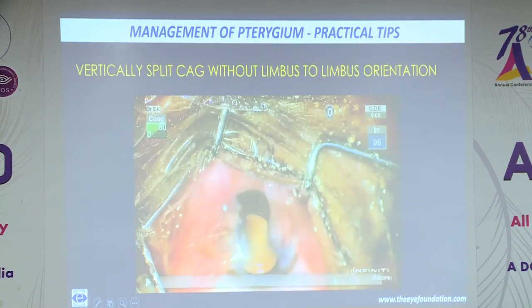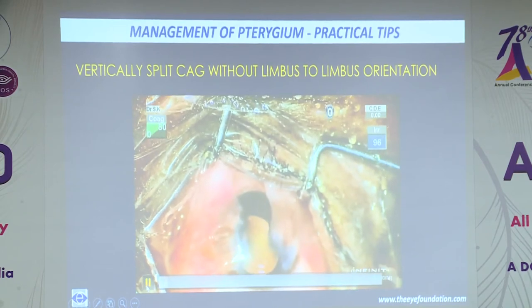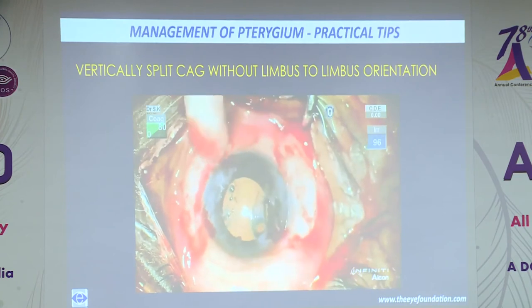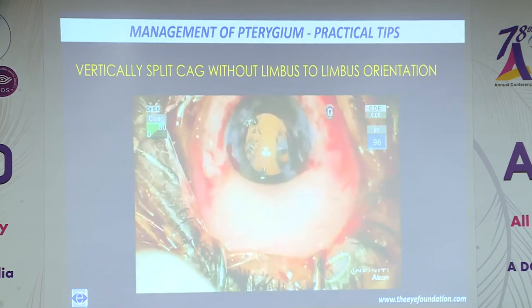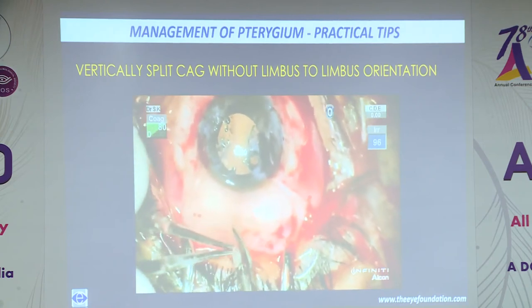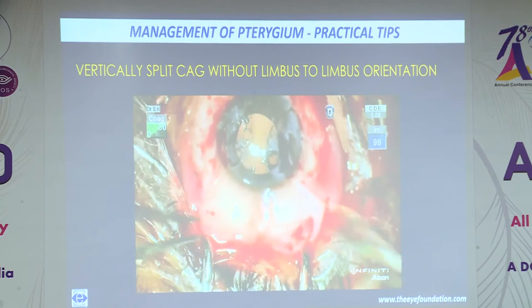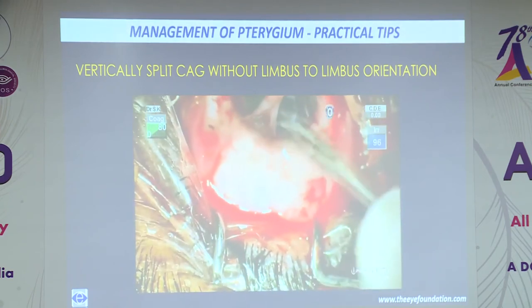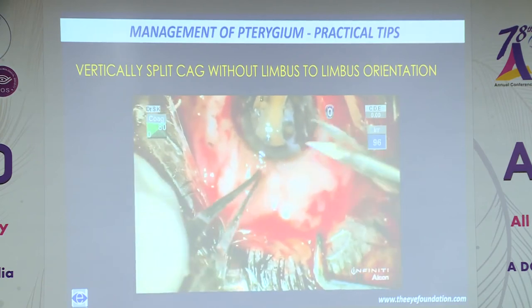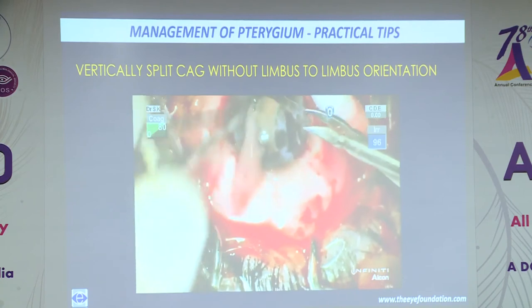Another case is almost grade 3 double head pterygium. You have a large pterygium and a large bare scleral defect to cover, so your superior bulbar conjunctiva may not be sufficient. If you have amniotic membrane, it is ideal, but if it is not available, you can split the graft into two parts, and without limbus to limbus orientation, you can slide the graft down and place it on the bare scleral bed.